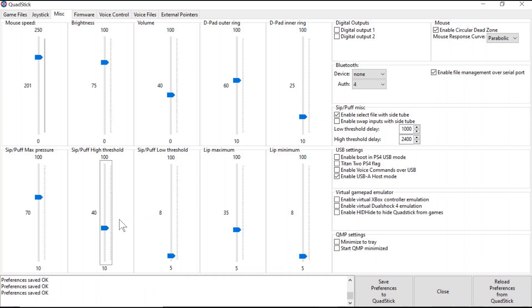The Sip and Puff high threshold is for the normal Sip and Puffs on the Quadstick, and the Sip and Puff low threshold is for the soft Sip and Puffs. I'm going to focus on the normal Sip and Puff threshold, which is the high threshold. Typically out of the box, the Quadstick will have a high Sip and Puff threshold of 40, which is generally a good threshold for most users with adequate respiratory strength.